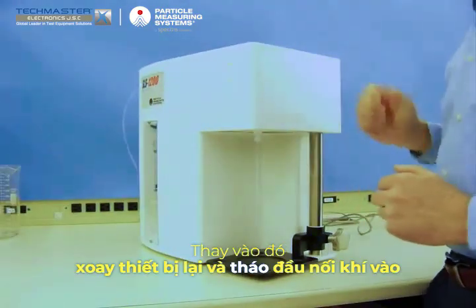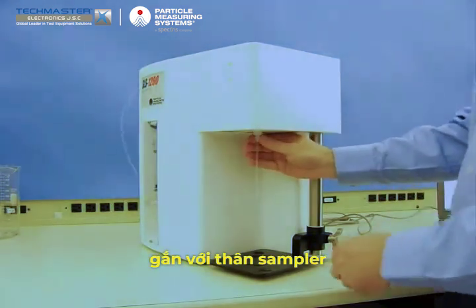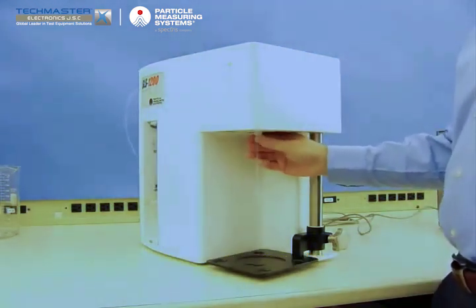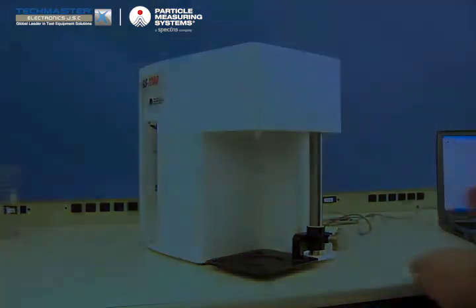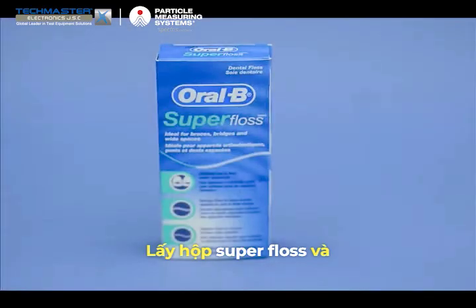Instead, turn the unit around and remove the inlet fitting connected to the sampler chassis. Once this step is completed, you are ready to begin cleaning. Retrieve the box of Super Floss and extract a piece of floss.